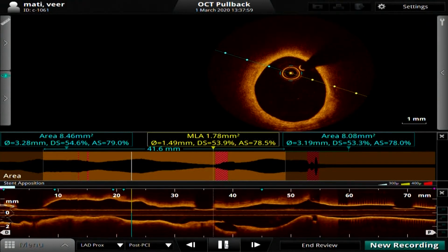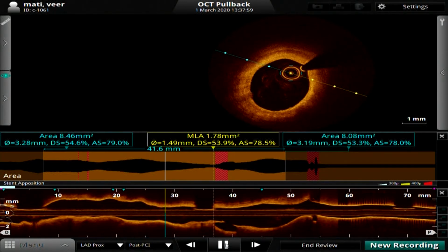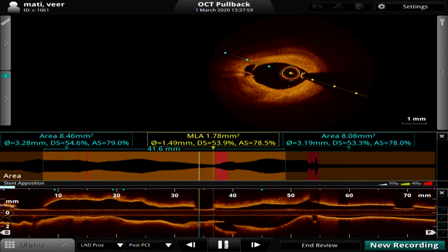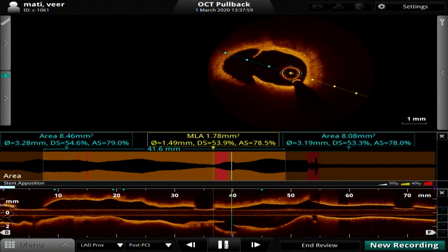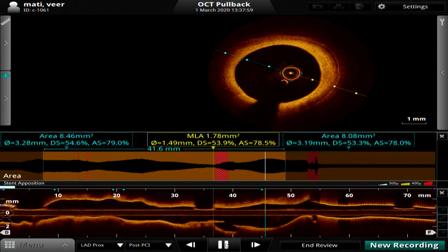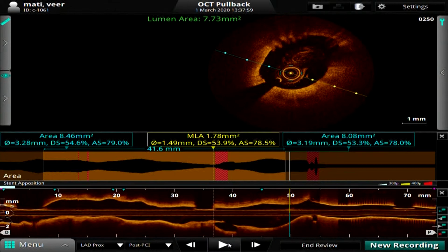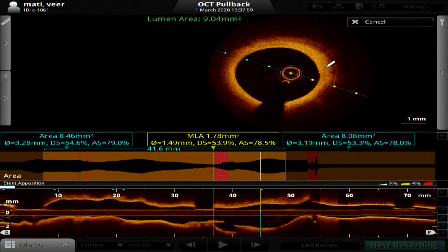So there is some calcification. Nothing that we can see. Looks pretty good. Yeah, it looks all right. There's some calcium, yeah, that's okay. Some dissection. And here is some ulceration, or plaque rupture, or your balloon injury, maybe. Yeah, plaque rupture, yes. It's a dissection. You're right. Dissection. And what's the size of the left main? It's a 4.10 is the size of the left main. Can you measure it?